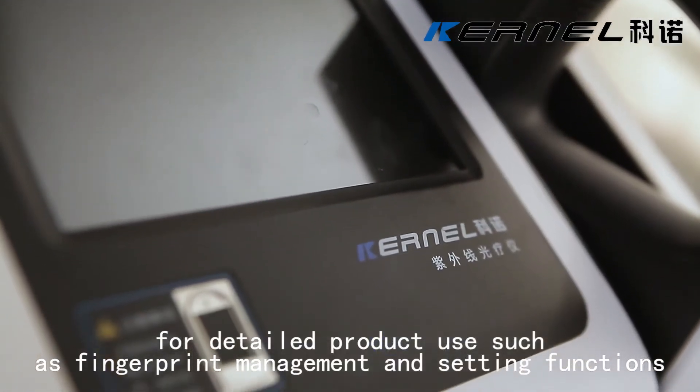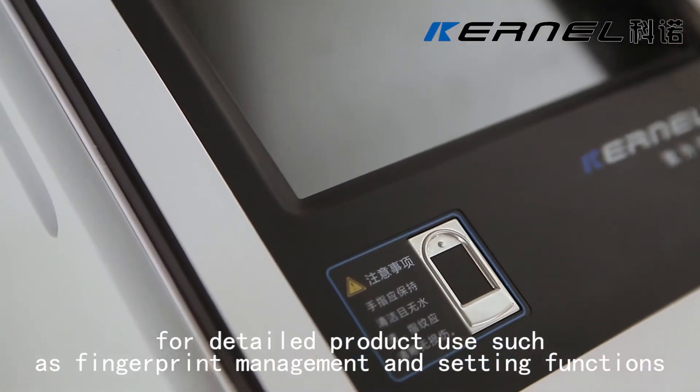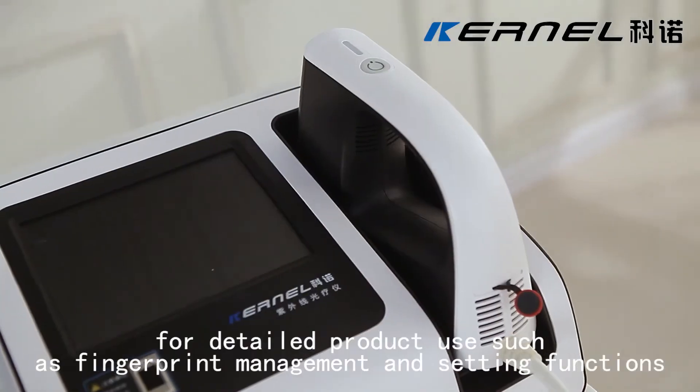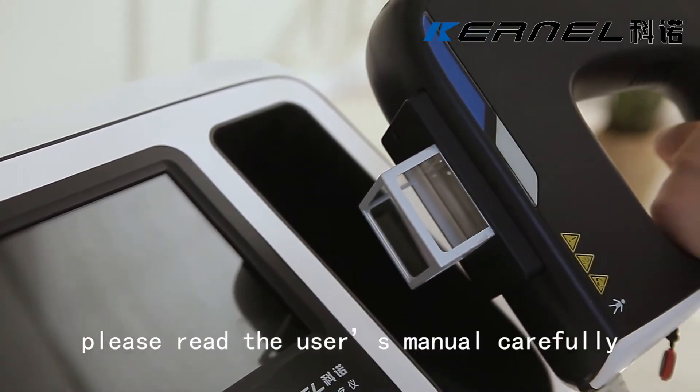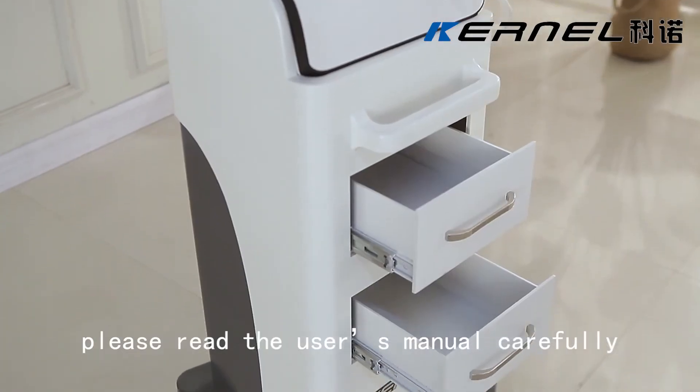For detailed product use, such as fingerprint management and setting functions, please read the user manual carefully.